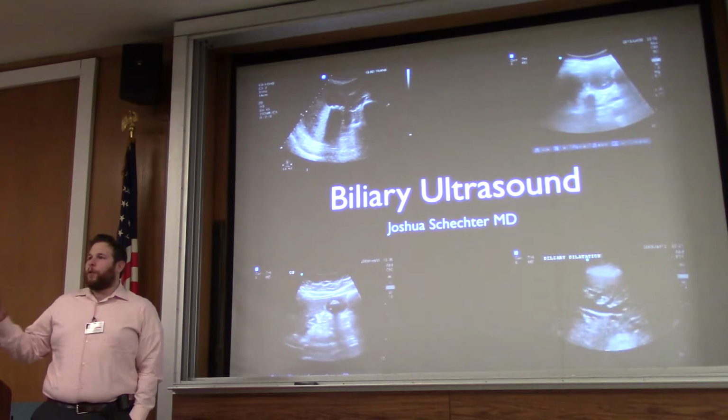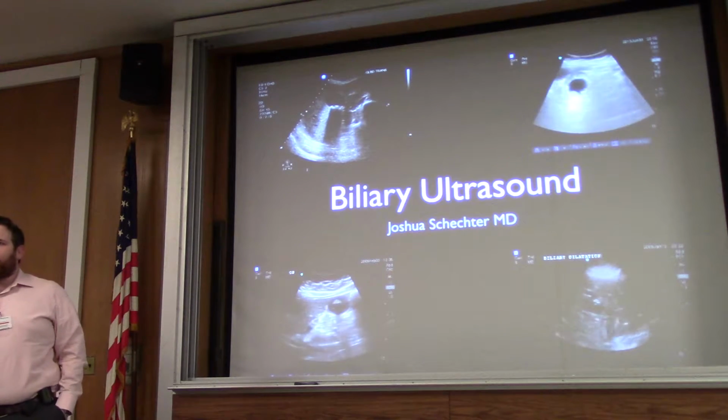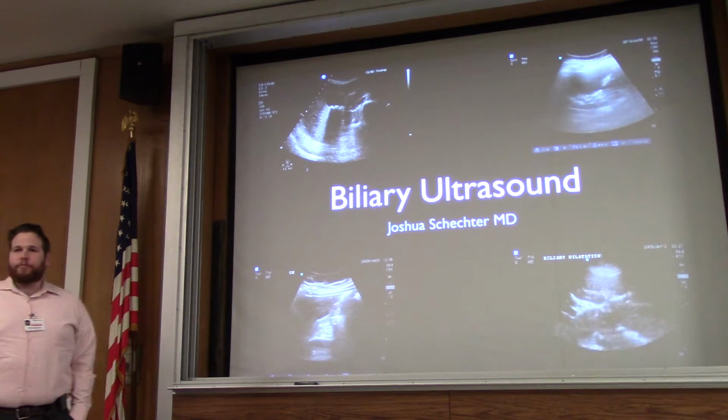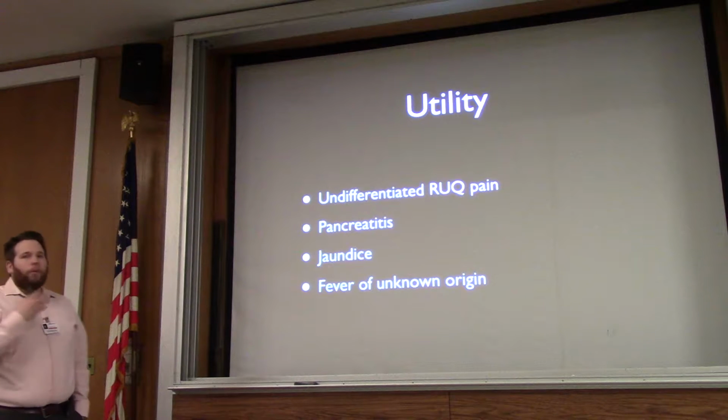But I think really the only way to get good at doing any ultrasound, gallbladder included, is by actually going out and doing lots of ultrasounds. You can hear my lecture 85,000 times over, but you're never really going to be good at it until you actually go out and do it. So let's go. Why do we do ultrasound?